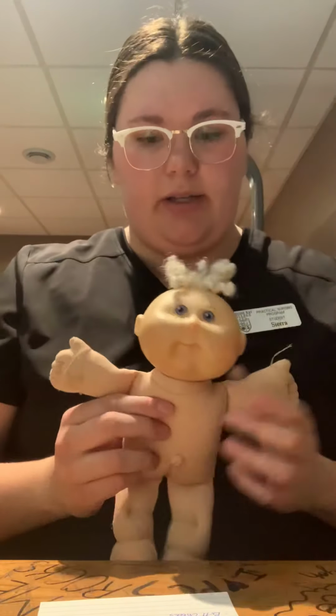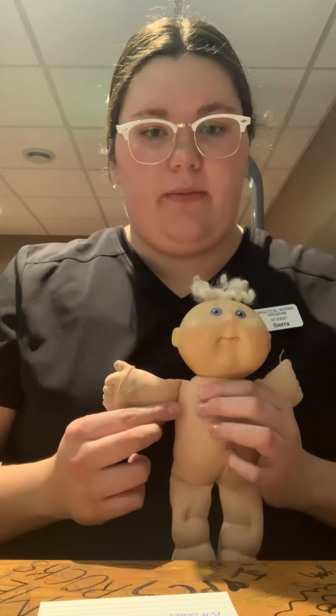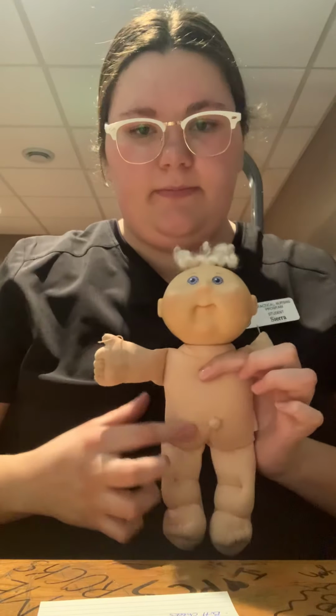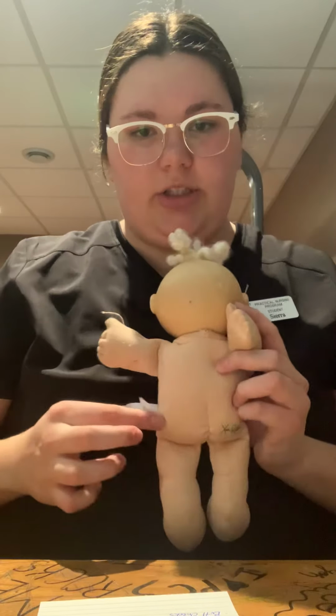So I have a little doll here. When doing your subcutaneous injections, you're going to want to use the fat in your arms, so right in here, in the back. Your abdomen, your inner thighs, and your butt cheeks.